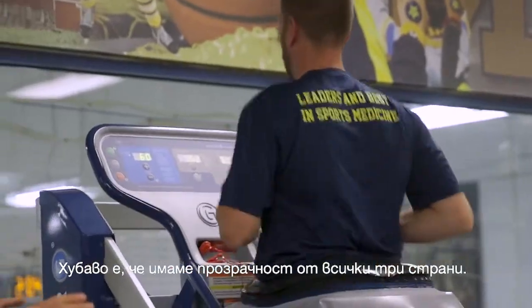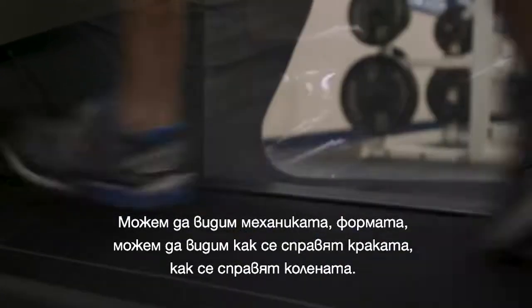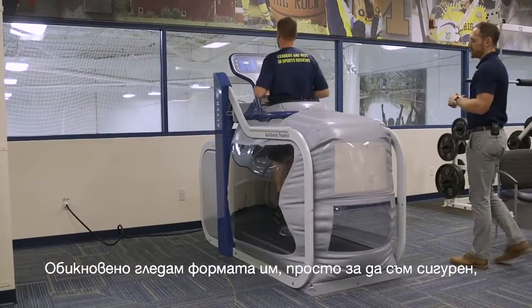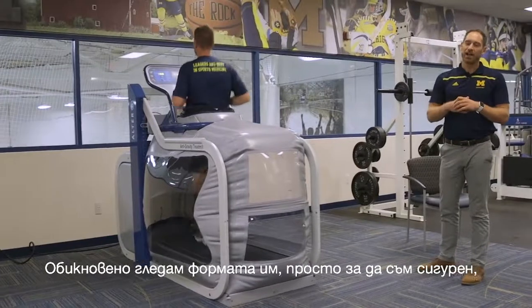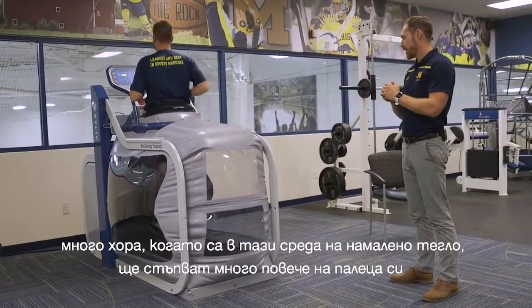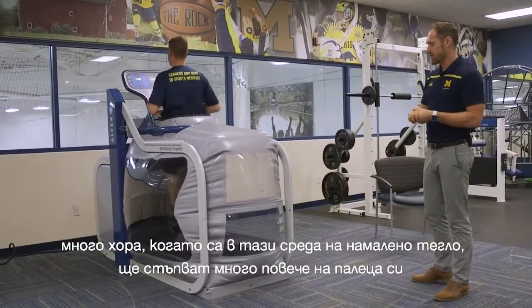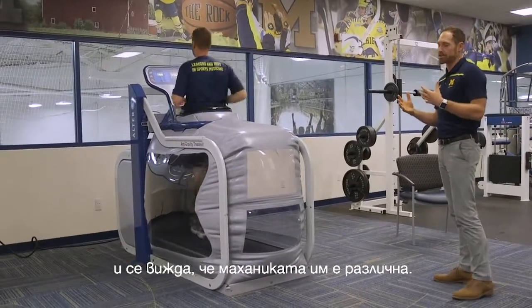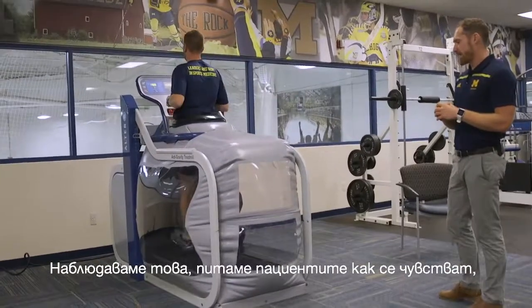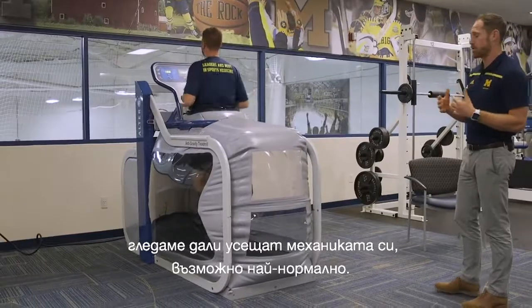The nice thing is we have windows on all three sides, so we can take a look at mechanics and form — see what the foot's doing, see what the knees are doing. Typically I'll take a look at their form just to make sure. A lot of people in that unweighted environment will almost hit too much of their toe, and you can tell that their mechanics are different. So we look at that and ask the patient how they feel, to see if their mechanics are as normal as possible.